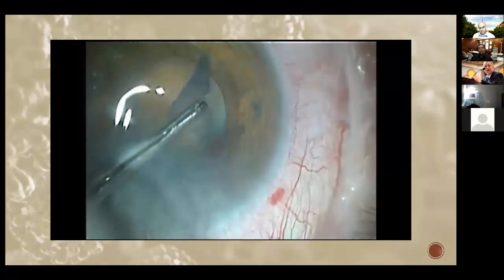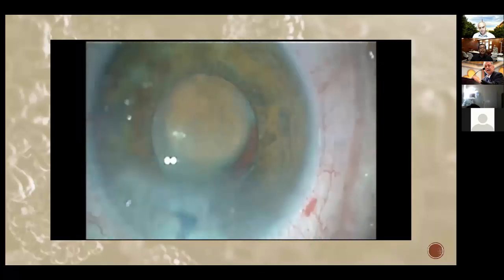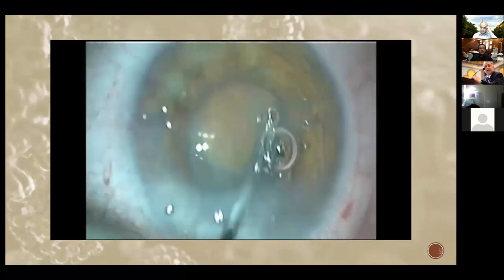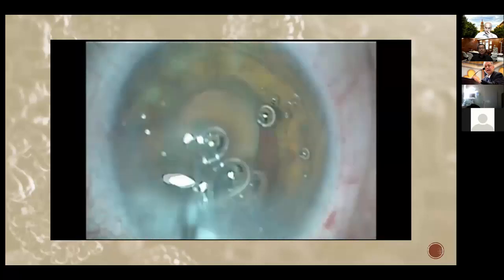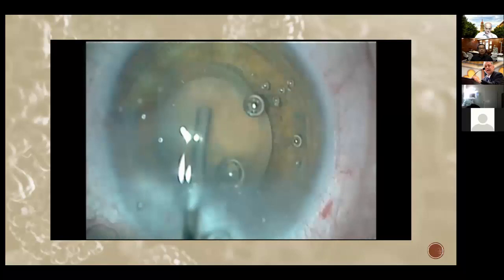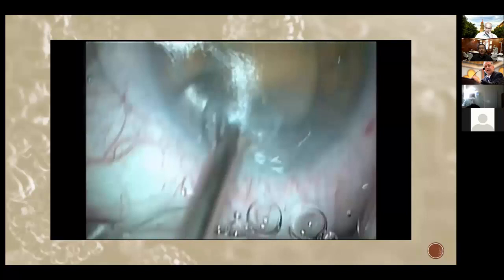Take the flap central. As you can see, the rhexis forceps is not the best in the world. And now I have my rhexis. It's a small rhexis, but it's a good continuous rhexis. And now I'm filling inside the bag with viscoelastic. I'm injecting viscoelastic behind the nucleus, the very small nucleus. And as you can see, it's a small nucleus, but it's very hard.